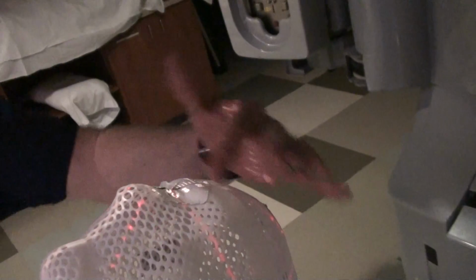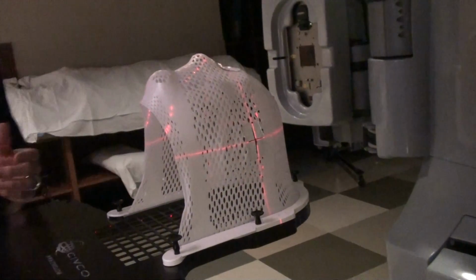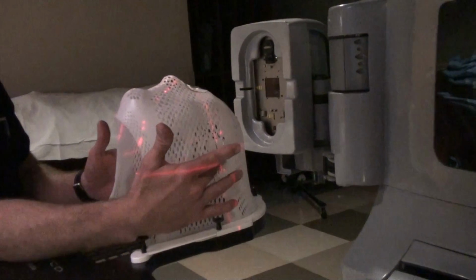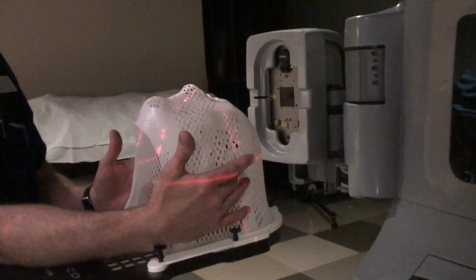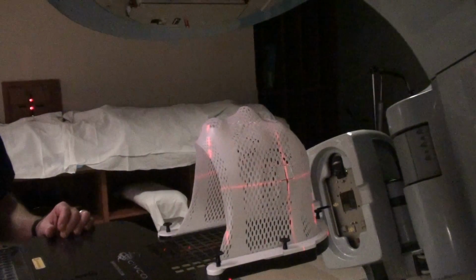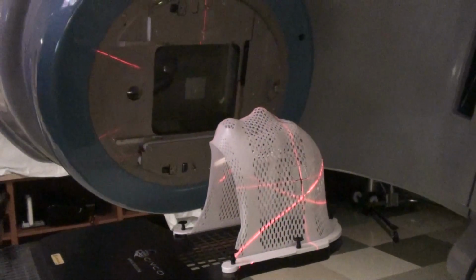When the person is set up in 3 points, usually this is going to be just a left and right lateral whole brain treatment, which means it's going to be mid-plane. So you're going to have equal or almost equal SSDs from both laterals. Okay, so you'll be equal distance from the right lateral and the left lateral. So I'm going to rotate the gantry over to the right lateral since you are on the patient's left. Once you're in place, the treatment will take place from each lateral, as I said.